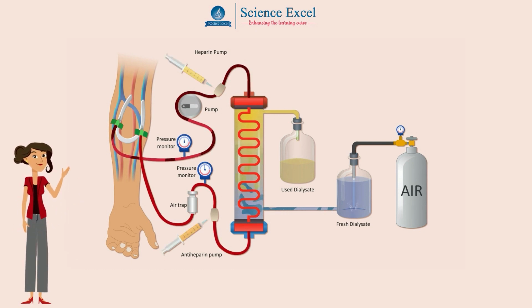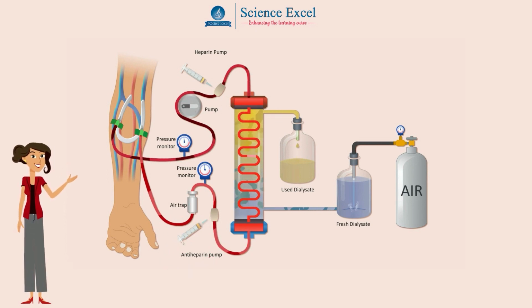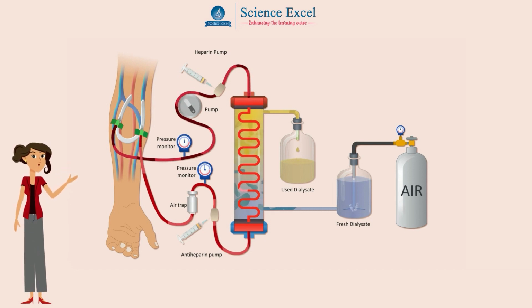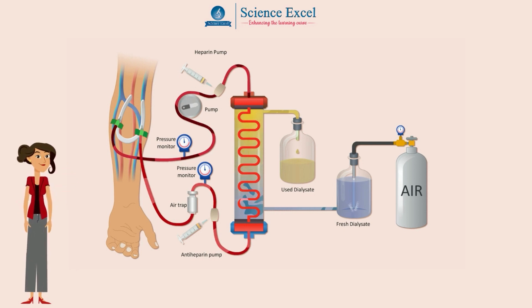The clean blood is pumped back into the body through a vein in the arm after adding antiheparin to it so that the blood regains its property of clotting. A patient with kidney failure has to undergo dialysis for 3 to 4 hours 2 to 3 times a week. With this treatment and a carefully controlled diet, the patient can lead a fairly normal life.